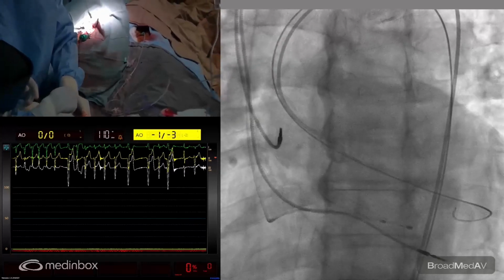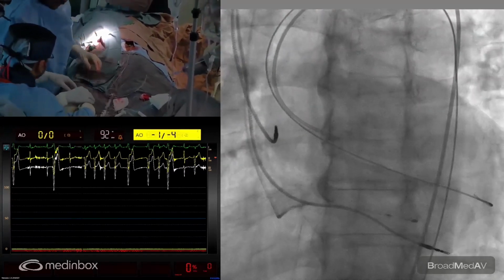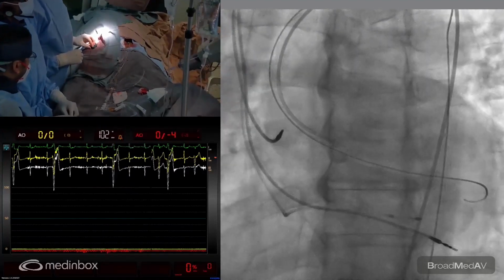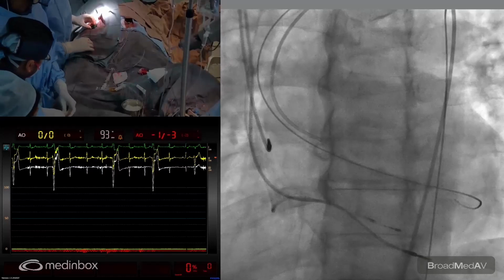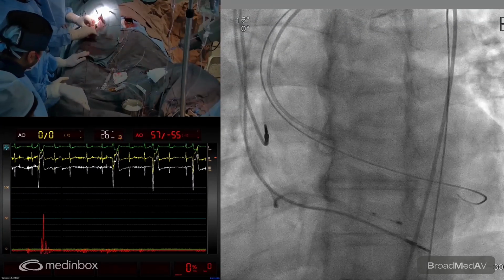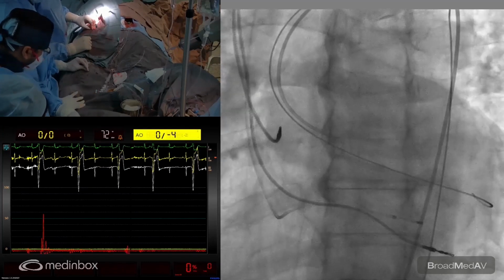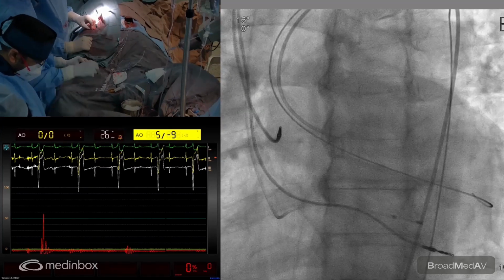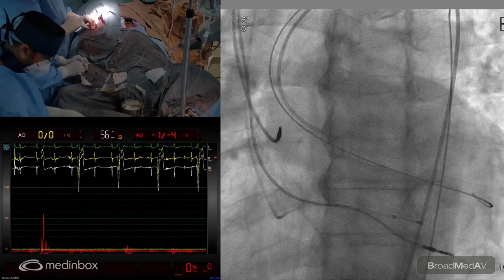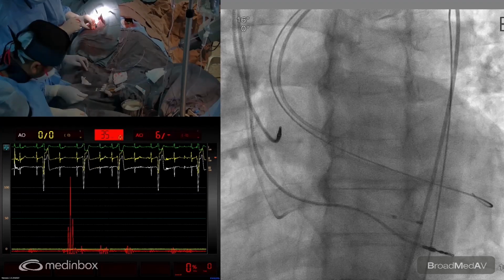The pressure is dropping, doctor. Just watch the pressure, anesthetist, Nanda. Okay, we're holding. So we got that out. And now we're going to put a pigtail in and then put this Safari wire, extra small Safari wire. So give me the pigtail.